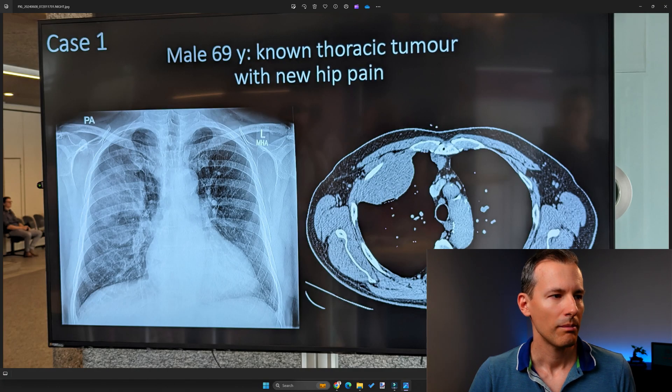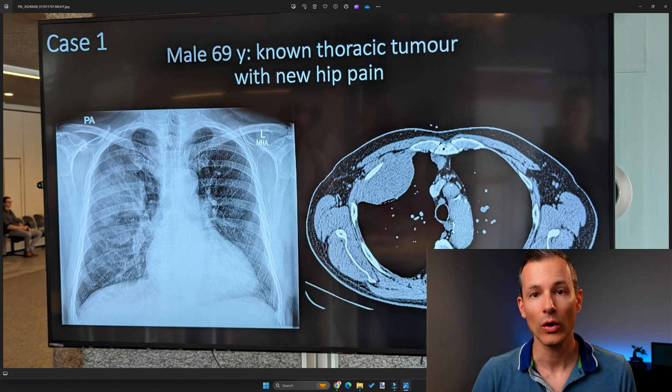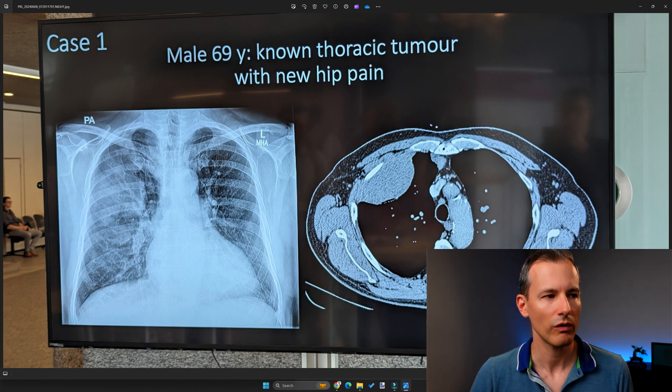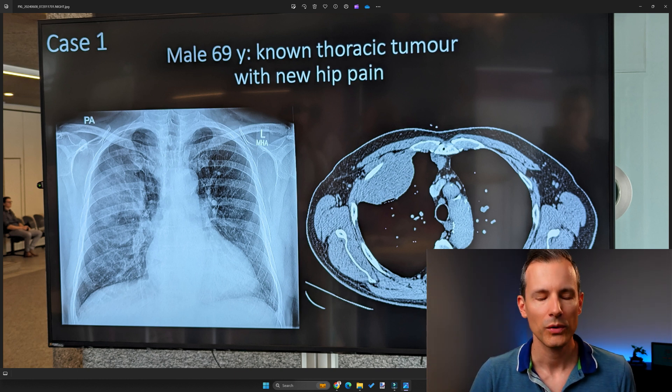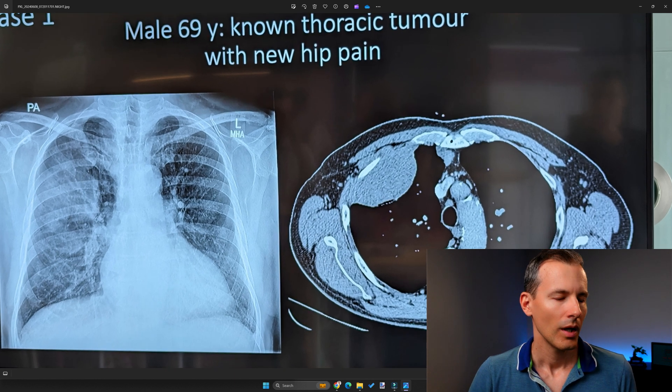Taking the case apart: the clinical information says 'known thoracic tumor.' Because it's known, I would expect it's not something super aggressive requiring resection or radiation — so this is something either benign or semi-malignant. Otherwise the word 'known' implies it's not a super aggressive tumor like lung cancer. And then we have new hip pain — so the tumor was long known and then new hip pain developed on top. The reason for the hip pain will be the edema.